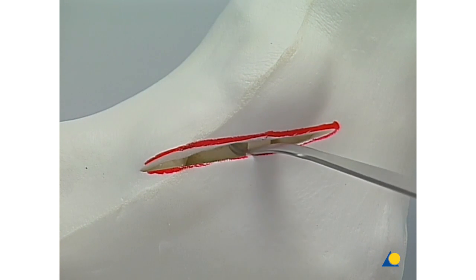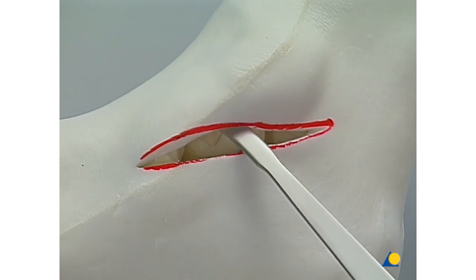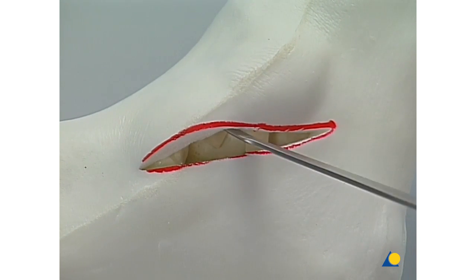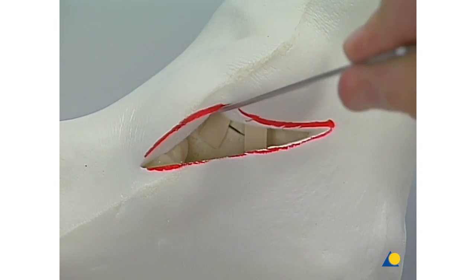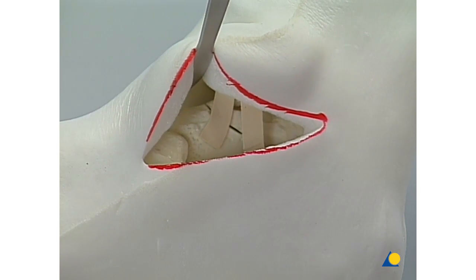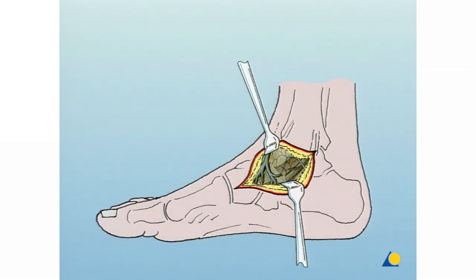A small retractor is placed on the neck of the talus to demonstrate the strong talonavicular capsule. The graphic demonstrates the local anatomy.